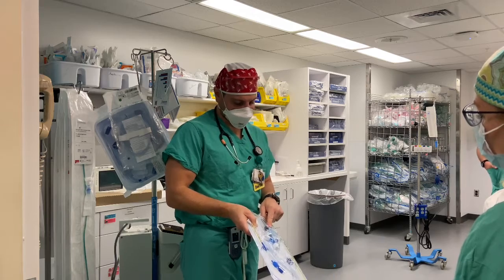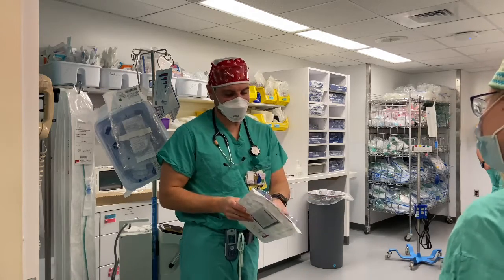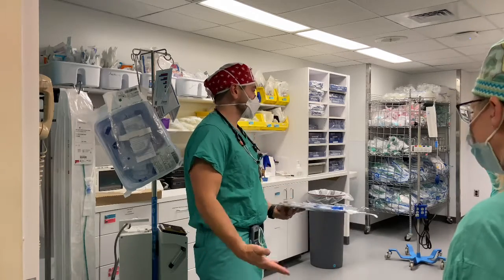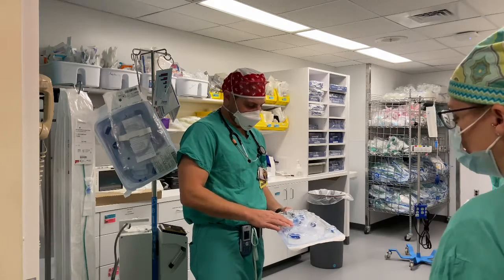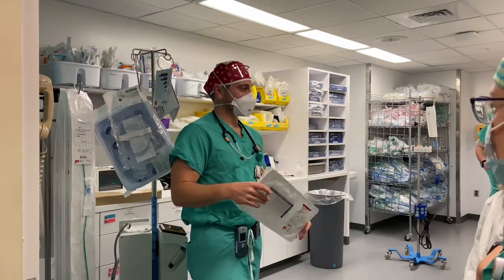So this is a connector that you could use to hook up to an oxygen supply or a suction, and either blow air in or suck air out. And this is another thing you could hook up to an ambu bag. You could actually ventilate somebody through this. Not effectively, but you know, in life or death, you could get some oxygen in. So yeah, that's kind of where we're at. Questions so far? Oh, very helpful.